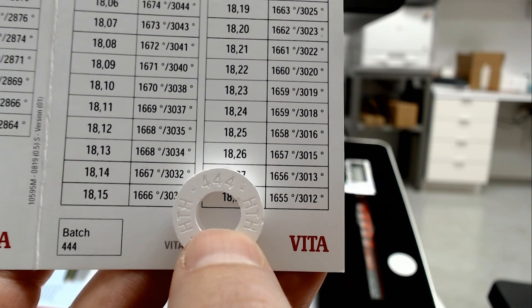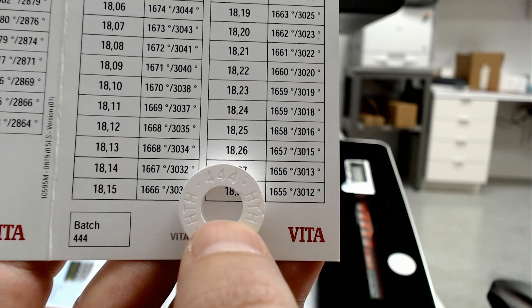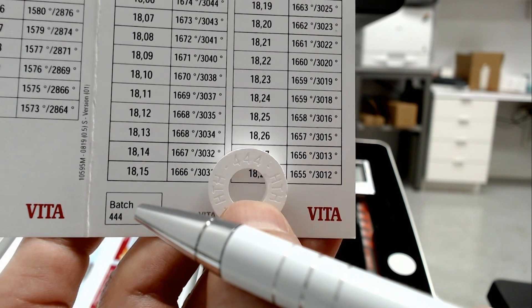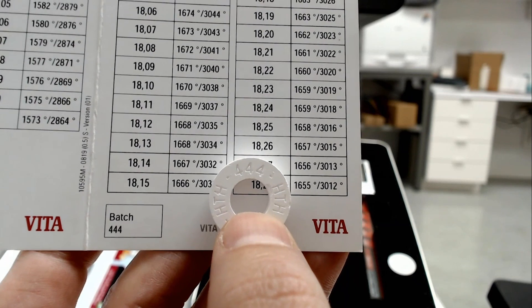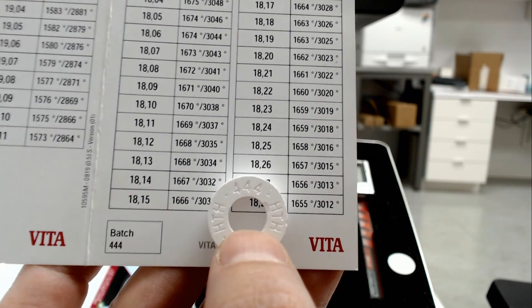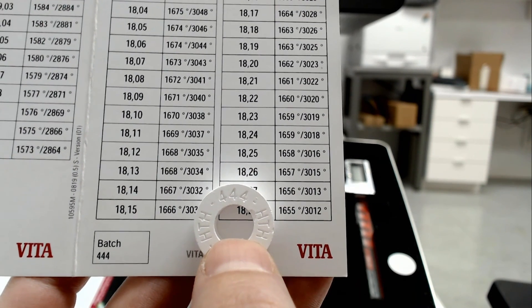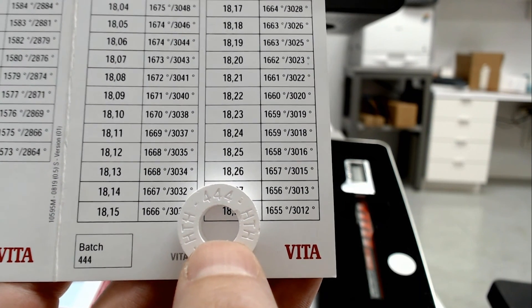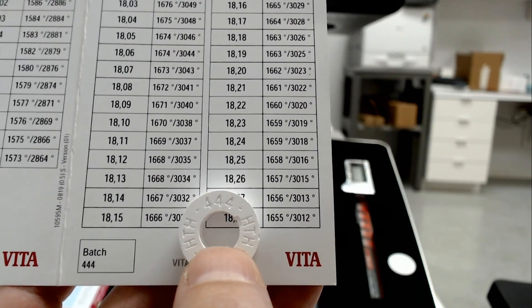An important note when using this calibration kit: make sure the number on the calibration ring matches the number on the temperature chart. Just like zirconia you're used to using in the lab every day, each batch of zirconia has a slightly different shrinkage value, and that's why you must pair them with the appropriate temperature chart. Also, rings from other manufacturers are not compatible in the Vita furnace and vice versa — they are specific to the company they're made for and the furnace they are meant to check, and are not interchangeable.